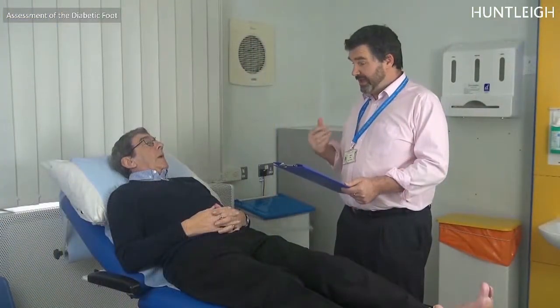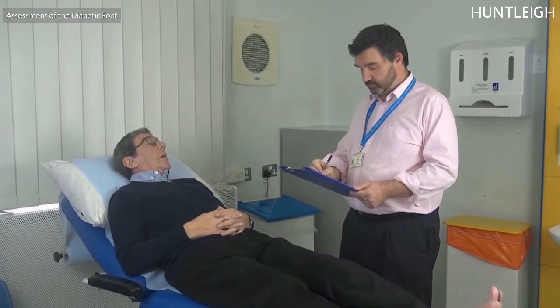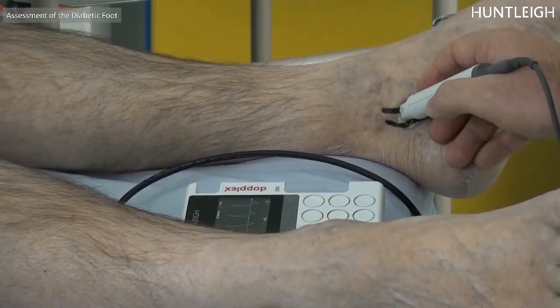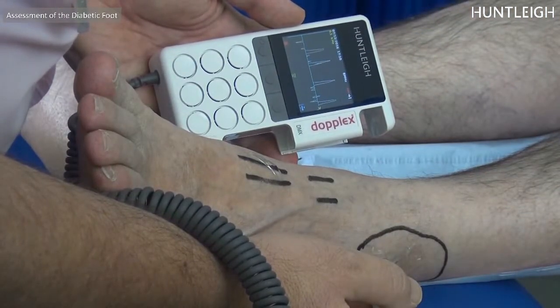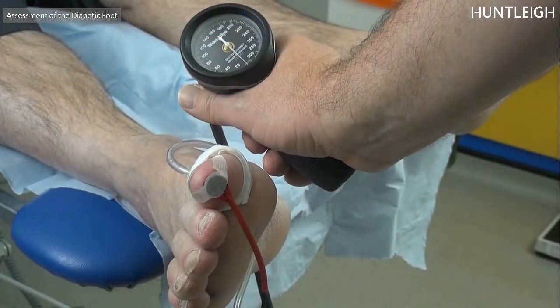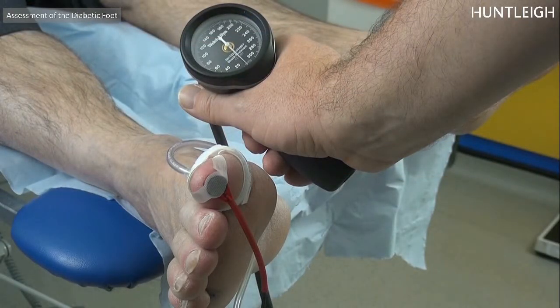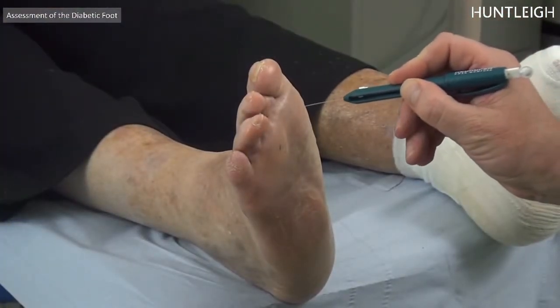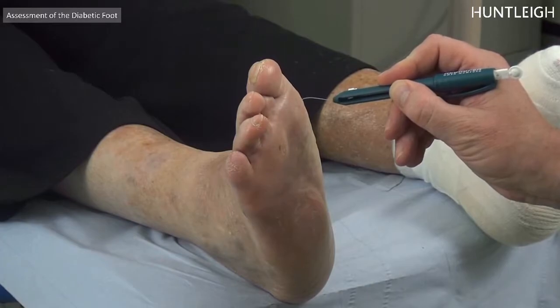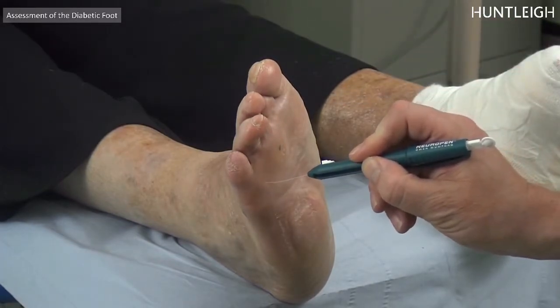This video is intended to provide the essential information for those involved in assessing the diabetic foot. We will be showing you basic lower limb vascular assessments using a handheld Doppler and PPG system, and how these methods could be used for more advanced measurements. We will also be demonstrating methods for detecting loss of protective sensation using a 10g monofilament and other techniques.